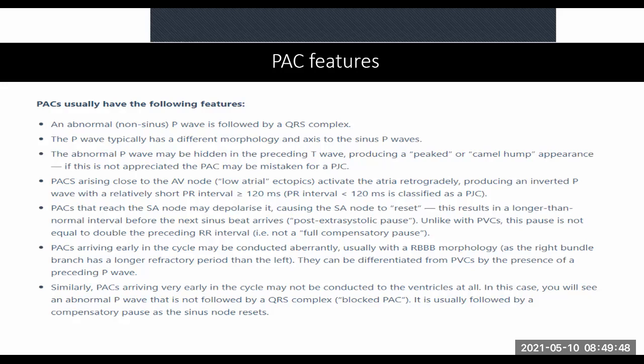Listen, when you guys have a chance to read through this, I'll leave it up on the screen for a few minutes. The truth be told, all of these things are very lovely to know, but in an emergency department it doesn't really help us because we're not going to go that in-depth into the patient. But these are lovely things. If you have a chance, especially if you're watching the video later, pause this, read through it and go through it. I fall asleep when I read all of these things because we never actually end up looking at all of them. We look at the bigger picture, which is the joy of the emergency department. You don't have to go into too much detail. Whereas a physician needs to know 30 causes of something, I need to know 3 and say, it's one of these 3, you take over and catch on.